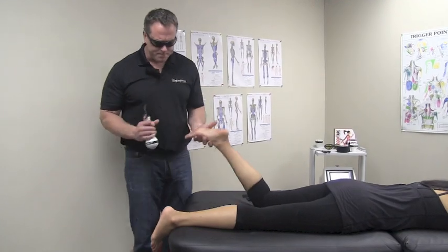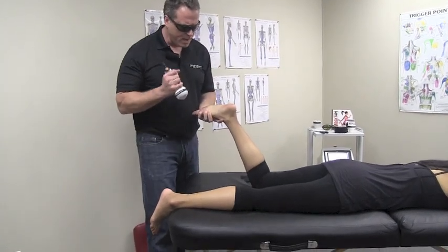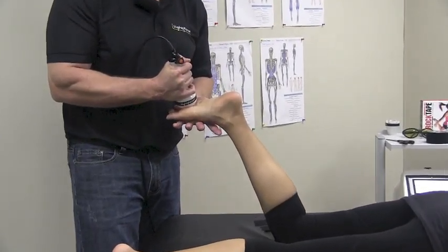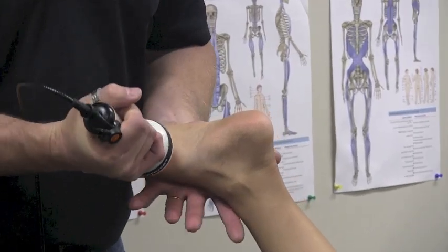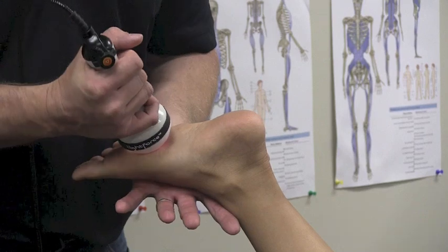When I move into the laser on the foot, I'm going to show you with the massage ball head — I'm going to apply a touch to the foot. If your client is sensitive or ticklish, just take it off the foot and go above there. Also consider the sensitivity level on the bottom of the foot in regards to how painful it is.